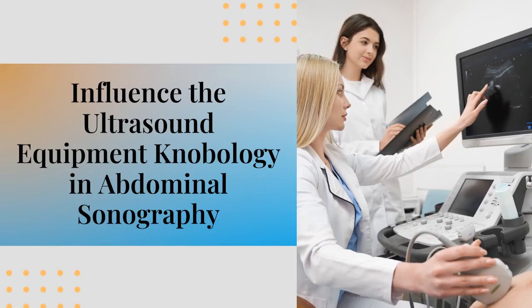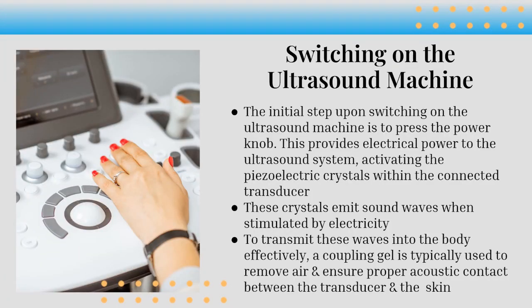Ultrasound equipment, knobology, and abdominal sonography. Switching on the ultrasound machine.